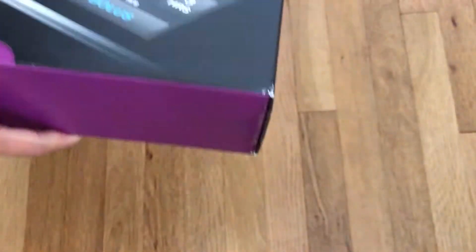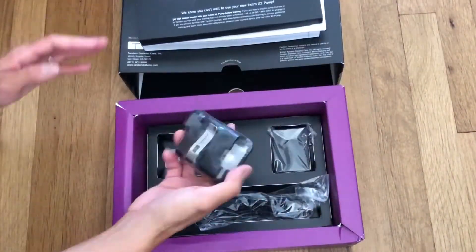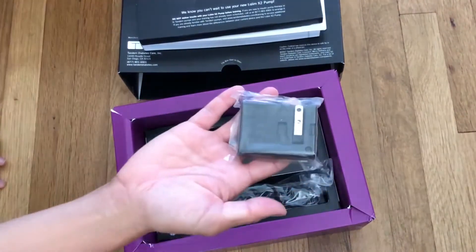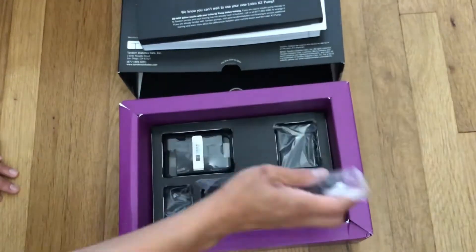It comes in this big box and has a really thick manual. It does come with the waistband holster to clip in the pump, the AC adapter, and the charging cable. It's really nice that you can plug this in to charge it.